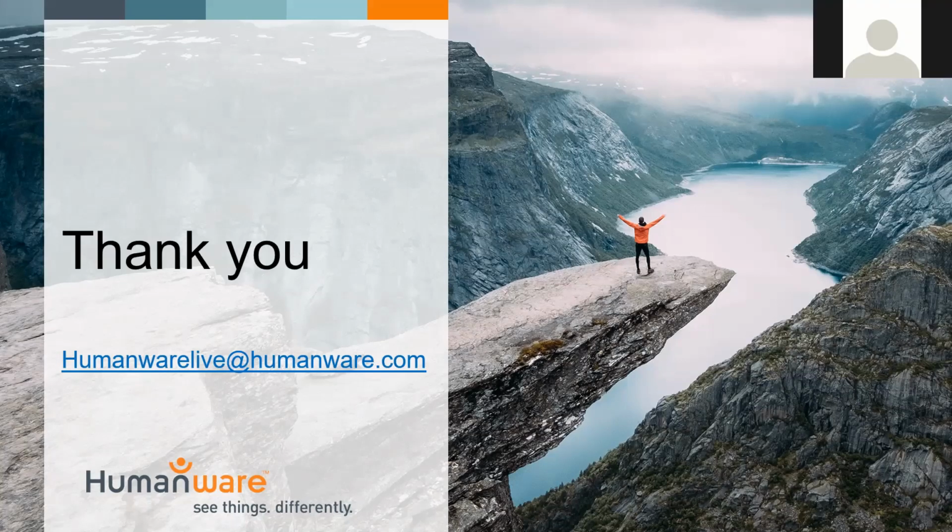Hello. Hi. I've not talked to you before, but I have a Mantis. Can you answer a question about a Mantis? Oh, of course, I'm happy to. Okay. I just purchased it, so I'm still learning it, and I do like the Notetaker because it has a QWERTY keyboard. I prefer that over the Braille keyboard or the Perkins Brailler keyboard.